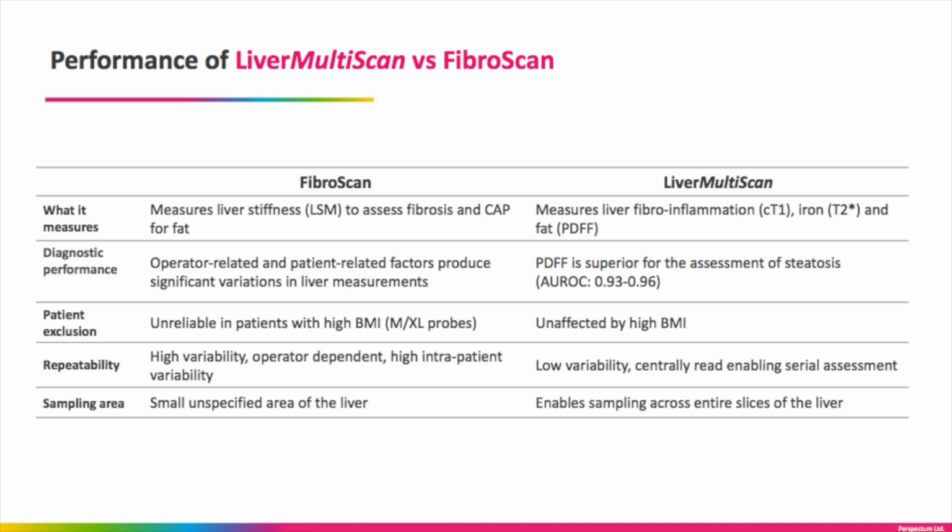In addition to this, PDFF has a low variability between measurements, enabling serial assessment to reliably monitor changes in liver fat content as a result of therapeutic interventions, which is of special interest in the clinic as it is in research.